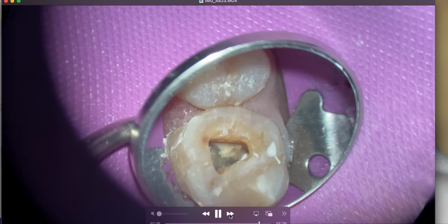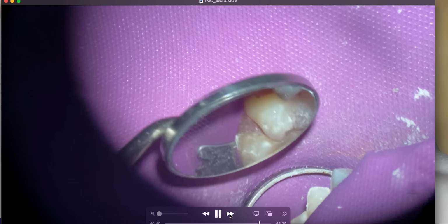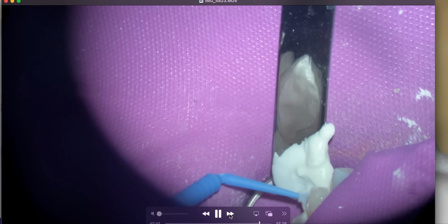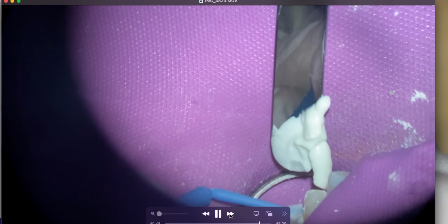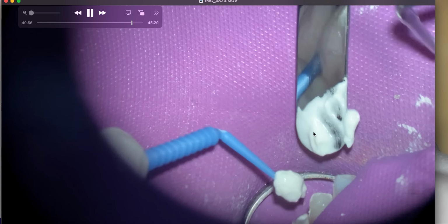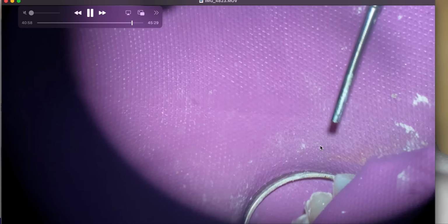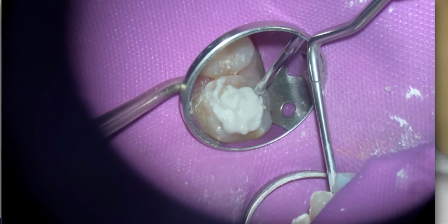Right there. And then, based on my friend's journal article, we're going to place powder calcium hydroxide. Now, I try to let my dental assistant do as much as possible. So she mixes the powder calcium hydroxide. There's no radiopacifiers in it, so when you see the radiograph, you won't see anything. So I get her to do as much as possible.